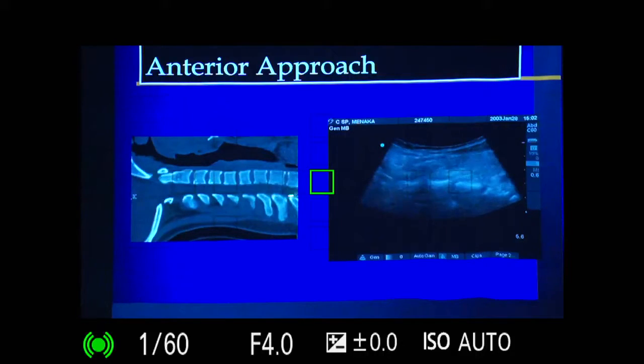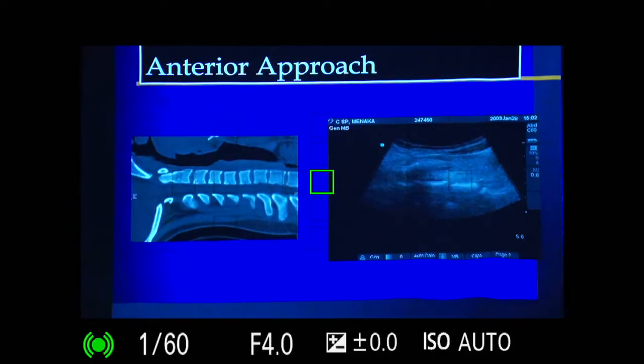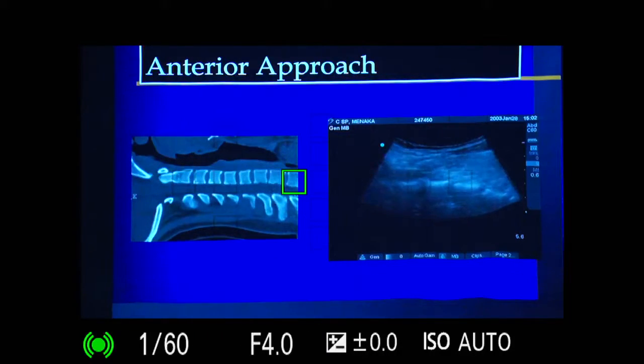and I have just put the CT scan horizontally for your orientation. And when we keep an ultrasound probe here, Dr. Bhoi, do you want to show? So, when you put your ultrasound probe in the anterior triangle of the neck, again the linear probe, you can actually see how beautifully, I will just show again. You can see every vertebra which is there. See, each vertebra with the intervertebral disc and everything you can see in the spine.